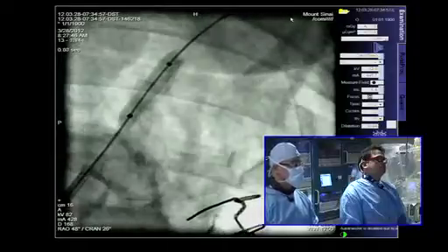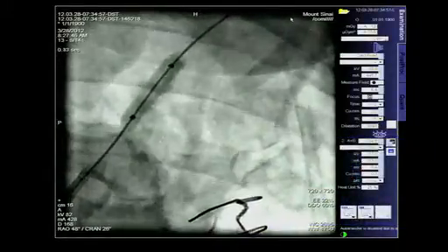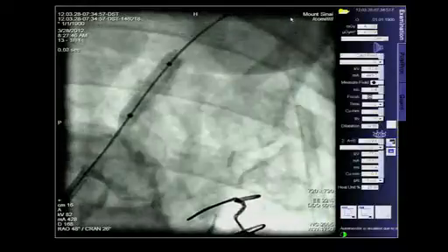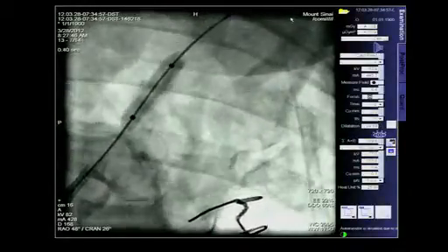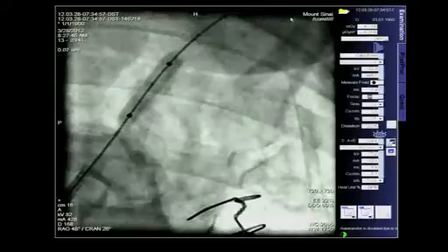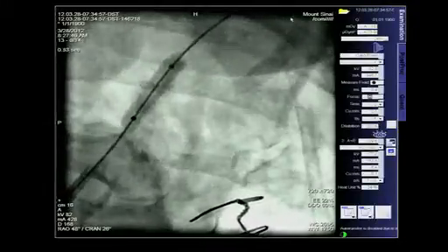And I think in this case, in order to be precise, a balloon expandable stent would probably be the best choice. So this was a 6 by 20 balloon, are you thinking of a 7 by 27 stent or something like that? I'm thinking about an 8, George. And ideally speaking, for everybody out there, you should be measuring. We have the luxury of the CAT scan as a measurement, and by CT measurement, this came out to be around 7.5 to 8, or 7.7 in certain areas.